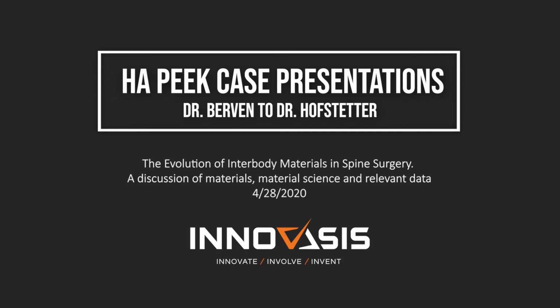Dr. Hofstetter, there was a question for you. You see the type of bone growth you're seeing with DBX on your cervical cages. What type of biologic are you using when you use these for ALIF? For ALIF, I do typically use DBX and an extra small BMP. So the smallest size BMP, I think it's 1.05, and DBX.